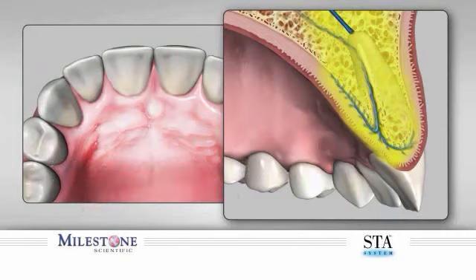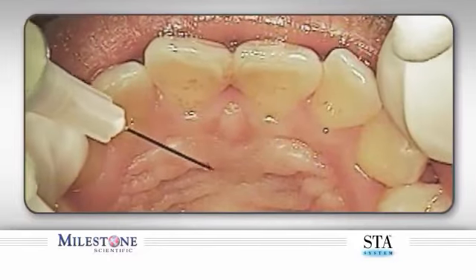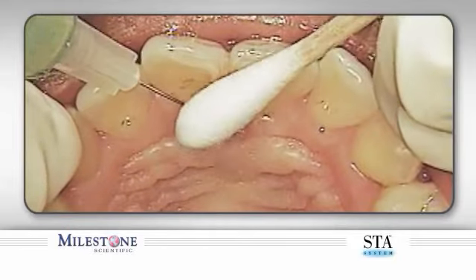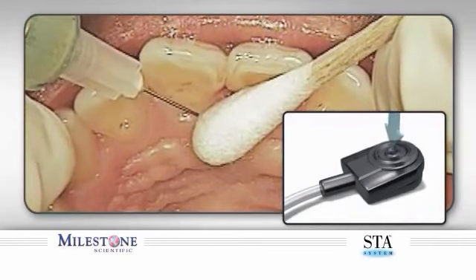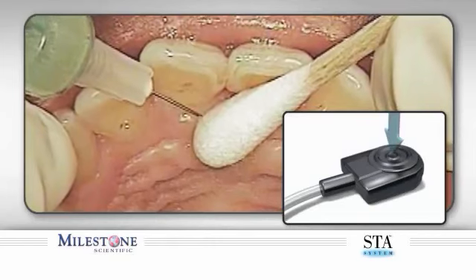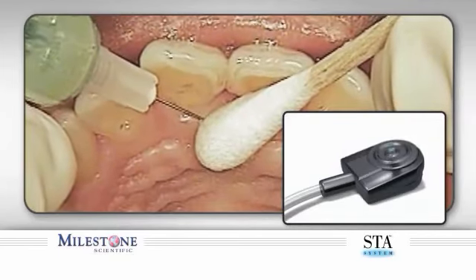We will now show a clinical example of the PASA injection being performed. You can see the needle is applied to the surface of the palate, followed by the placement of a cotton applicator. The flow of anesthetic is begun by initiating the STA cruise control. Once the needle bevel enters the tissue, pause forward movement for an additional 4 to 5 beeps before advancing again.